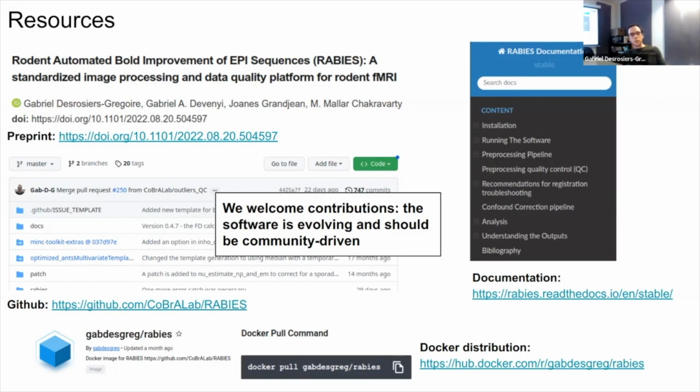Yeah. So most of what I've covered today, except maybe for the distribution plots at the end, is in the preprint as is. But there's definitely additional detail in the preprint on how I came up with these metrics and the justification for why they were selected, and some observations on how different datasets perform in terms of data quality, how correction can influence these outcomes. So I also invite you to look through that.